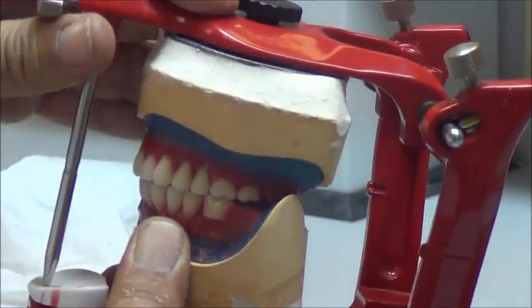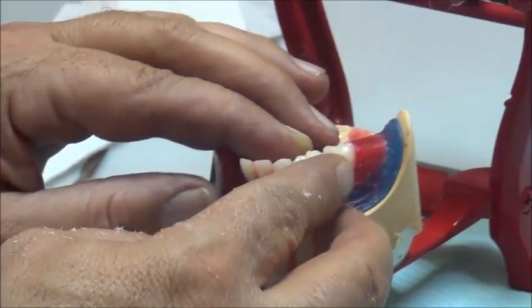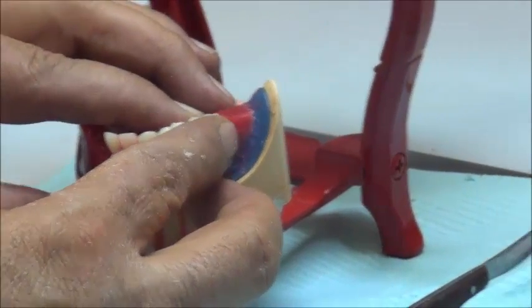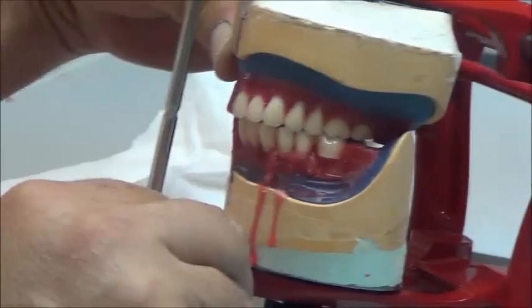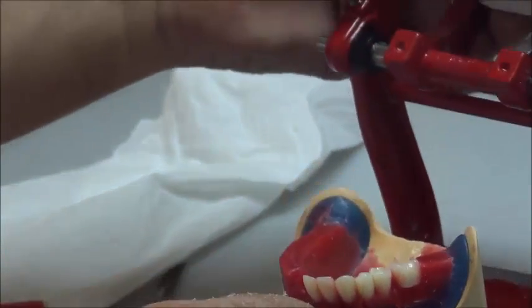So if it's underdeveloped and you get the set where the first premolar is closer to the canine, we don't do lingual adjustment. But if the morphology of your teeth on your set of teeth has a lingual cusp, we interdigitate it with the upper as we did with the second premolar.